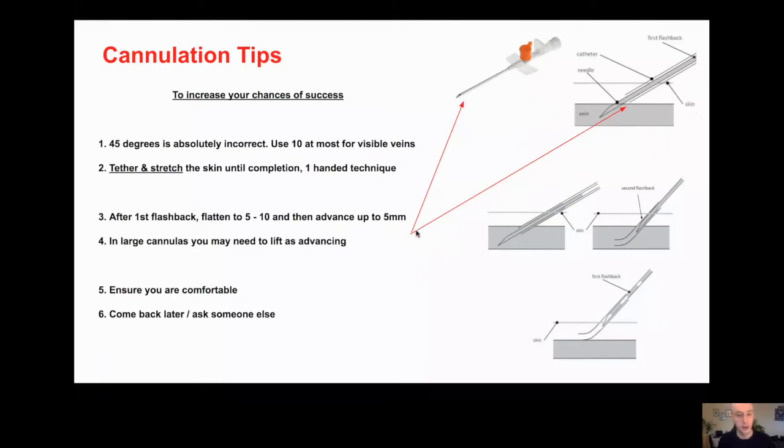There's a tip that you can see on YouTube for putting in large cannulas where they talk about lifting up the vein. So if you looked on this needle here, the sharp bit, the cutting bit, is this point here. This flat edge and this non-acute angle here, they aren't sharp, and you can run that cannula, the top of it, along your finger, and you feel it won't cut.